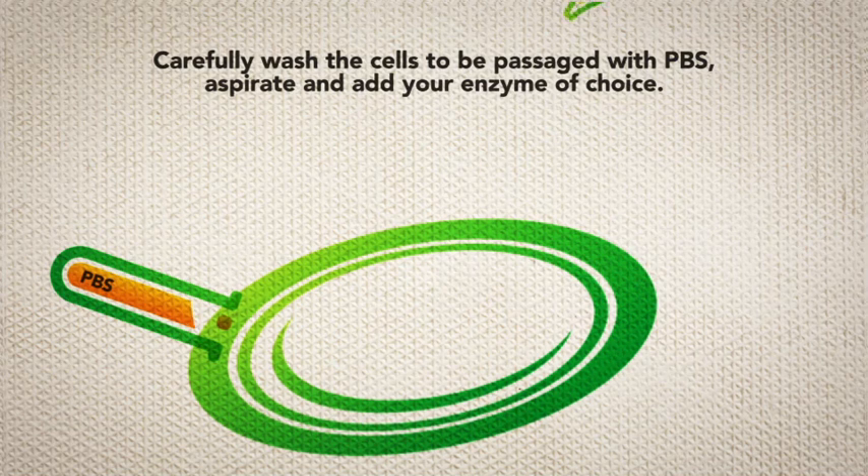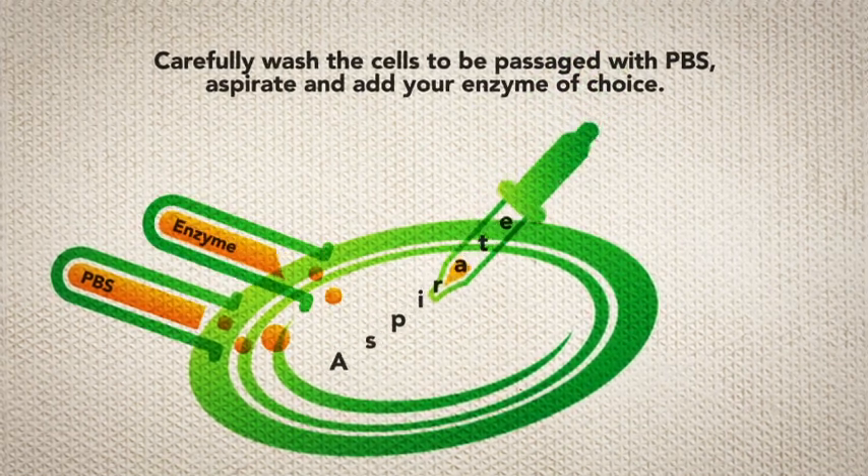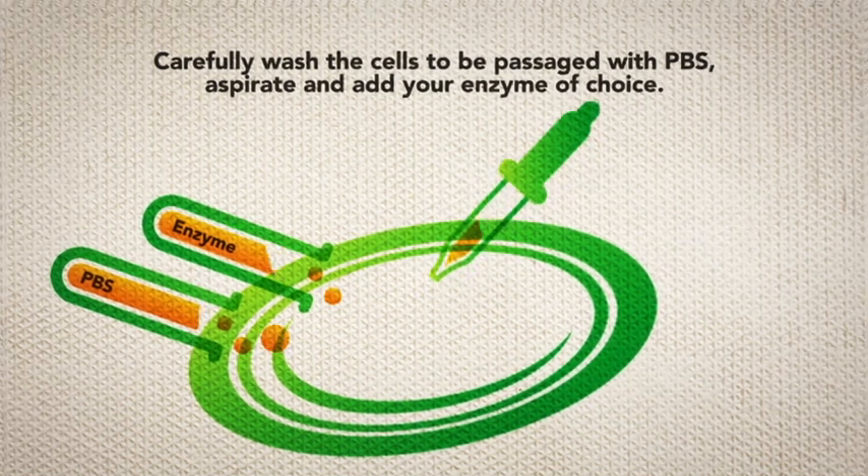Carefully wash the cells to be passaged with PBS. Aspirate and add your enzyme of choice. Inhibit the enzyme and gently pipette your cell suspension up and down a couple of times.